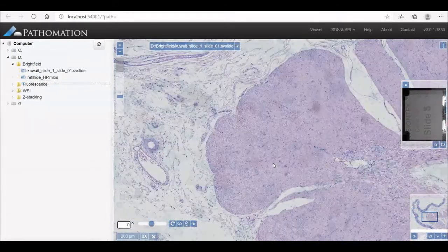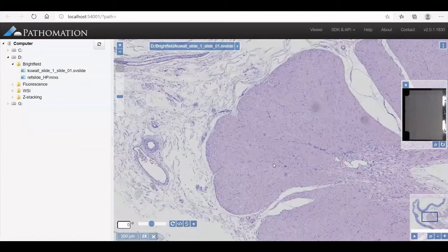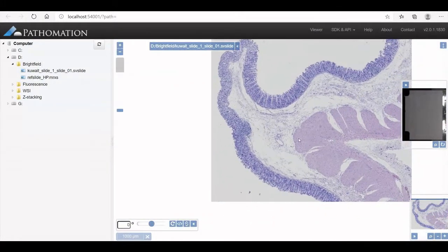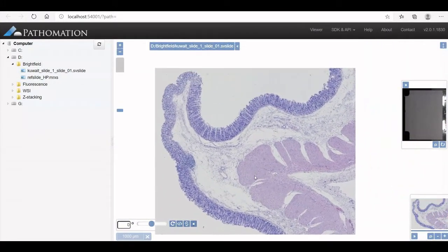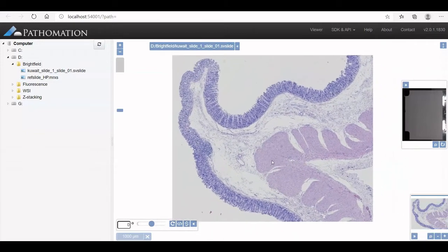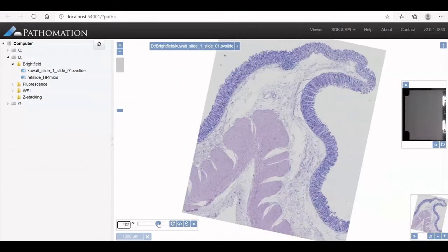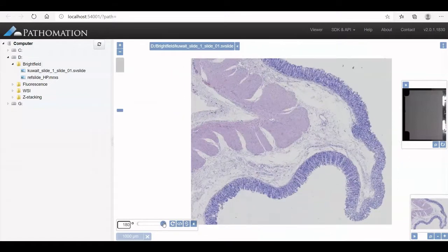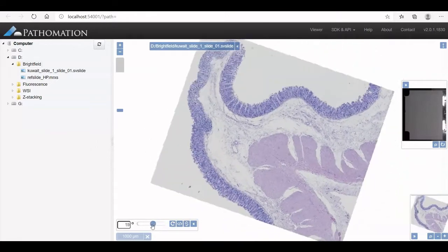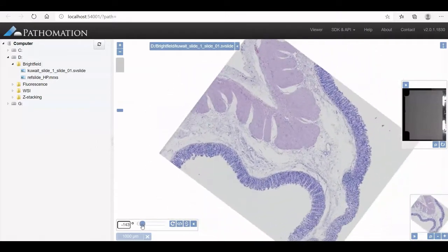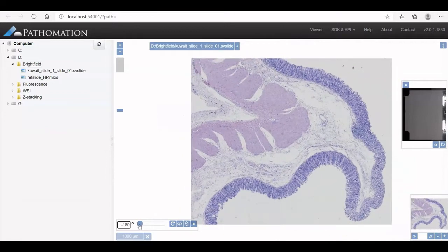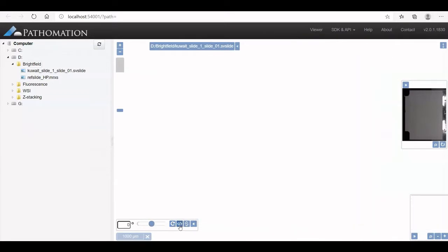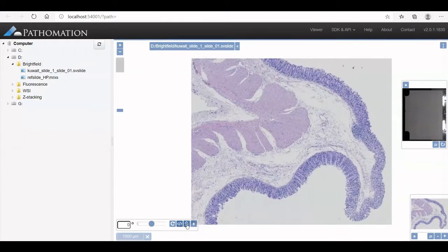All images can be zoomed in and out. You can move the image around. You can rotate and you can reset the rotation. You can flip your image horizontally and vertically.